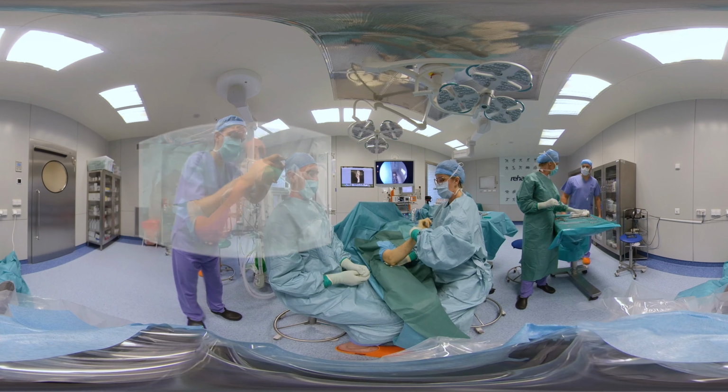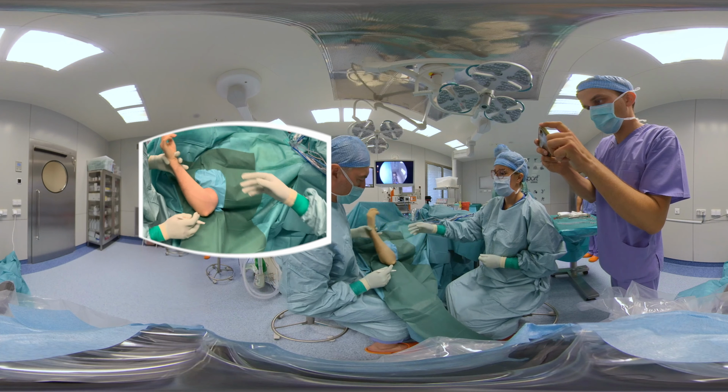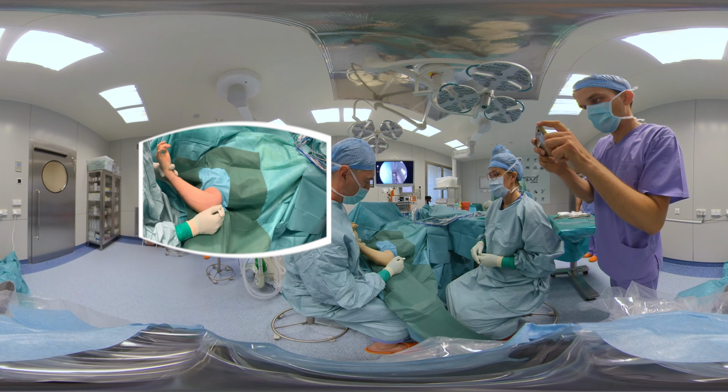Before starting the procedure, anatomic landmarks should be outlined, including radial head, lateral epicondyle and olecranon on lateral sides, and medial epicondyle, olecranon, and ulnar nerve medially.